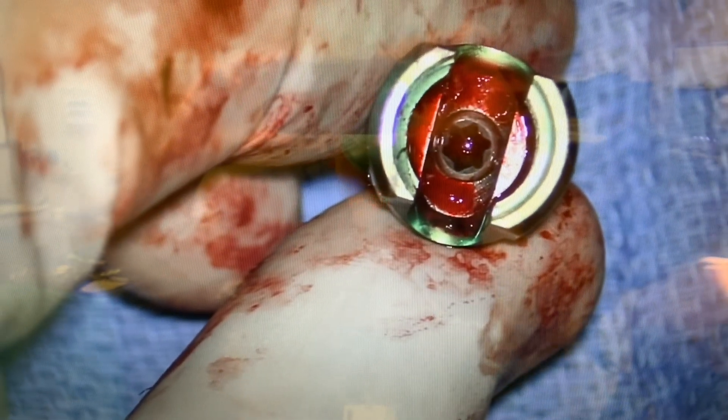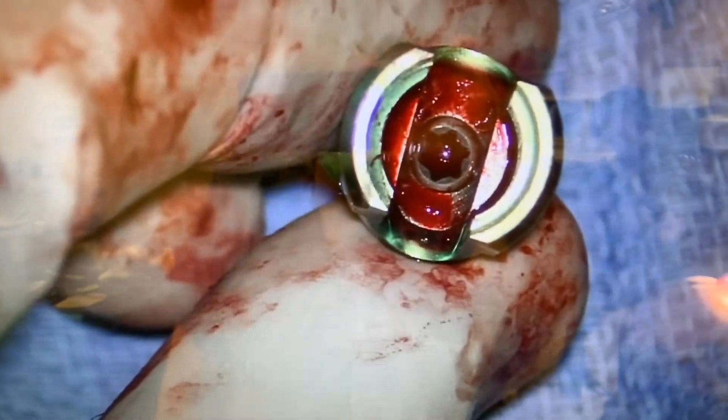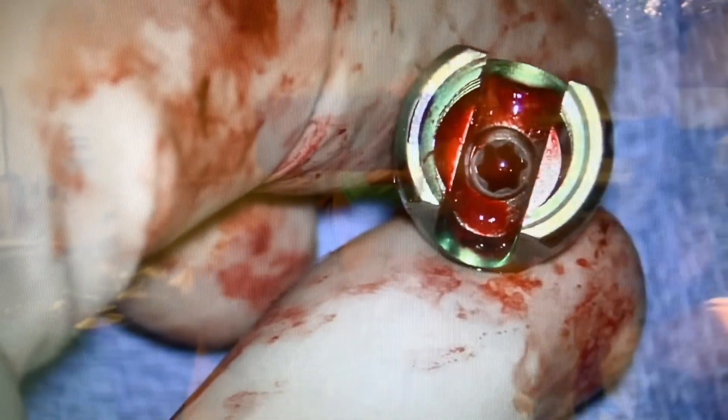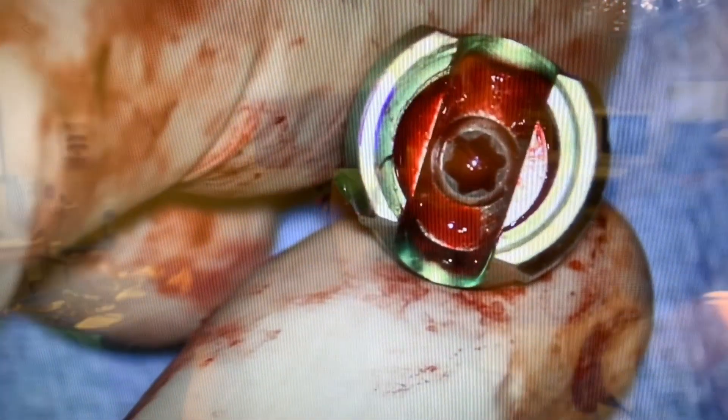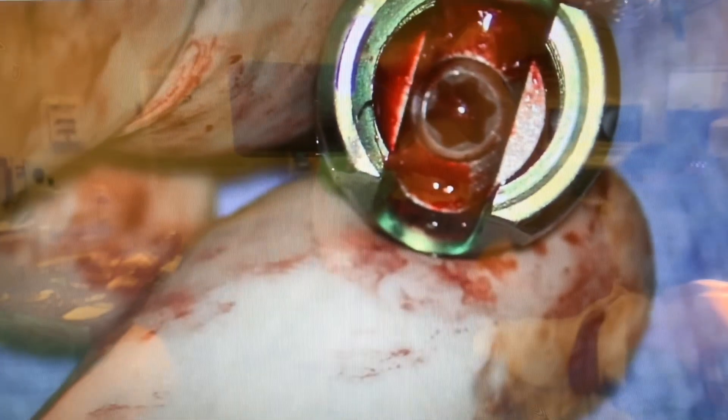This shows you a video of the inner screw, which is always the hardest one. It looks like a Star of David — six points. I did not have this screwdriver during the surgery, but luckily I had the Synthes spinal screw removal set and found a screwdriver head that worked: a 2.5 millimeter hexagonal head. You can see it easily moves the screw. It's a variable angled head, which is why it moves like that.